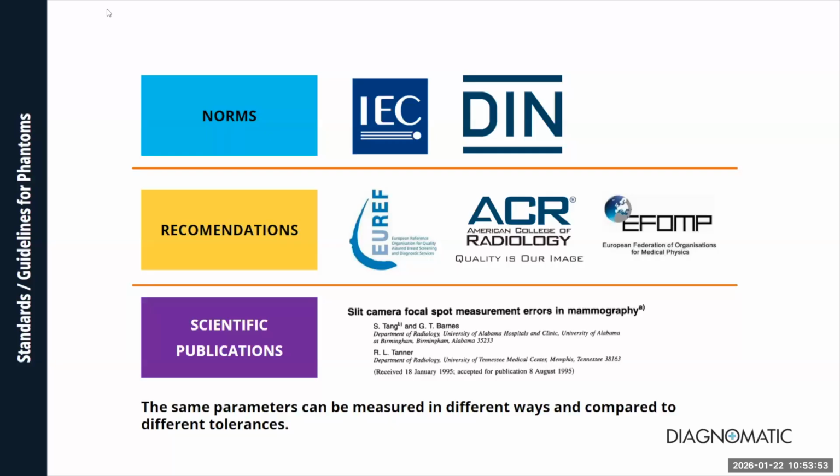A very important body is the American College of Radiology. The guidelines that they announce are widely considered the standard, not only in Europe but also in the Middle East and in Asia. So not only in America. Some of the tests are based on scientific publications.